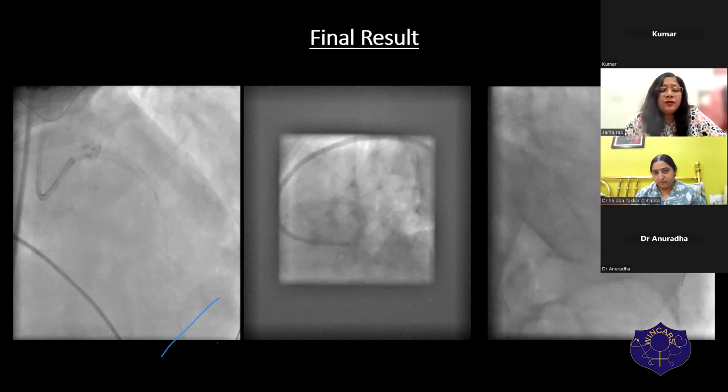So I felt safe at that point going in and putting in the stent, because with the stent balloon, we only give nominal pressures. I knew the moment I gave a high pressure over there, my stent is going to open up beautifully. So I was very sure at that point that this is going to open up. So you have to have that degree of confidence in the tool that you're using, also because you've imaged.